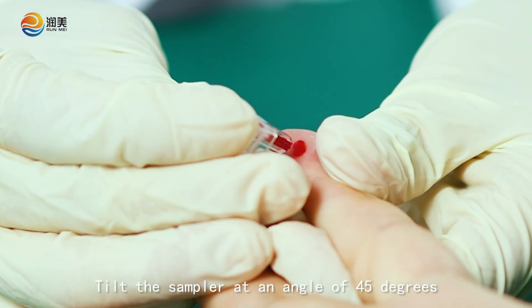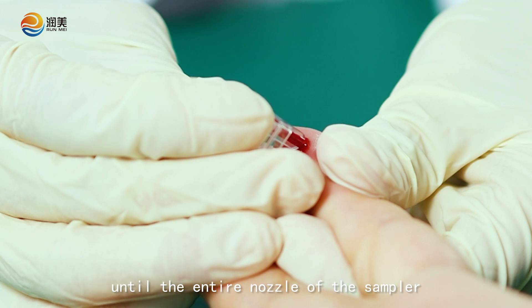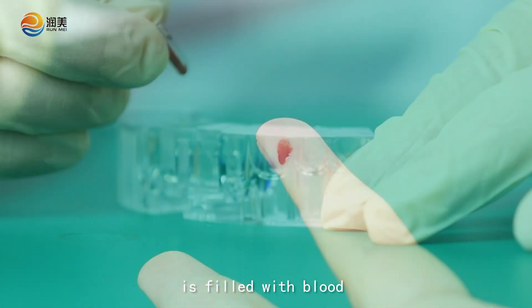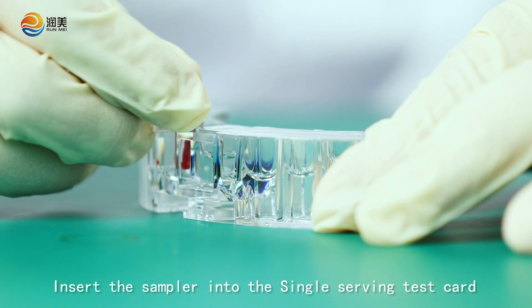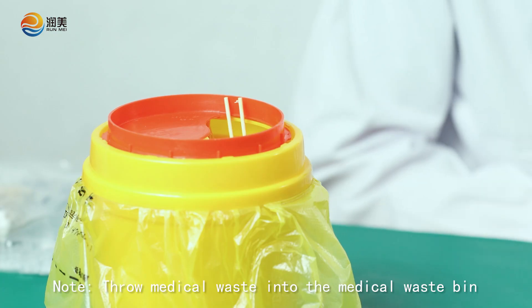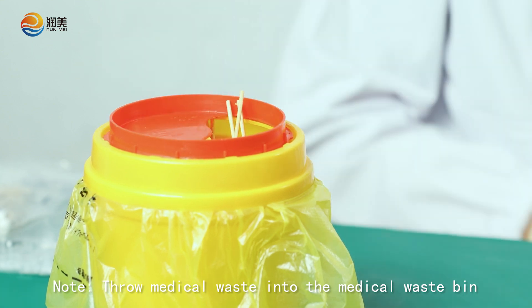Tilt the sampler at an angle of 45 degrees until the entire nozzle of the sampler is filled with blood. Insert the sampler into the single-serving test card and press it firmly. Throw medical waste into the medical waste bin.